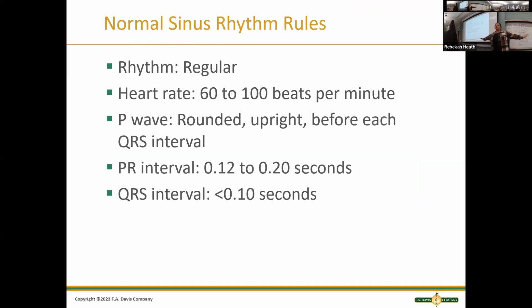Normally, if the sinus SA node is in charge, then we're going to see the normal sinus rhythm. Now I want you guys to get used to saying normal sinus rhythm because there's some other rhythms that can be stimulated from this SA node that aren't normal. They can still be abnormal rhythms that still start at the sinus node. So normal sinus rhythm, you have your heart rate, right? Between 60 and 100 beats per minute.